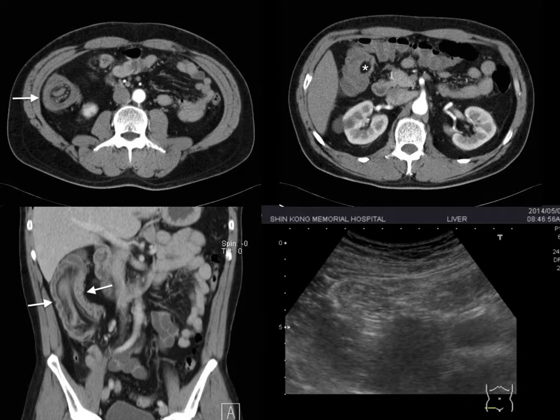And this is a series of the CAT scan, the transection and the transverse sections, and at the leading point, here we use the transverse section. You can see the target and the sausage or sandwich-like appearance. So we now have the CAT scan image in your brain.